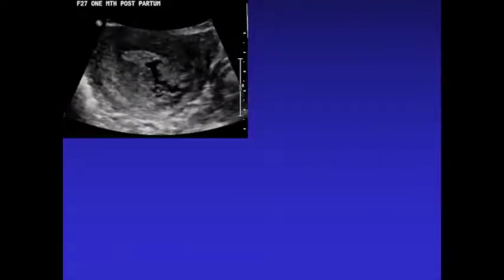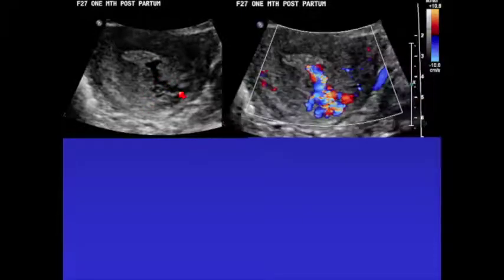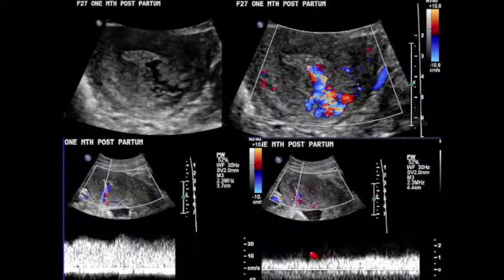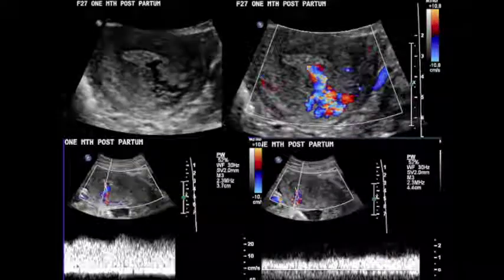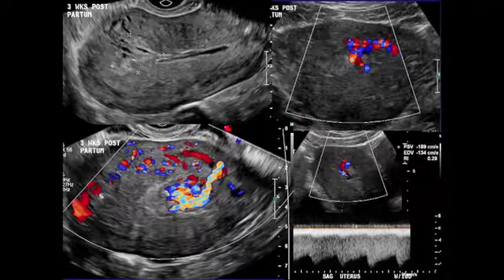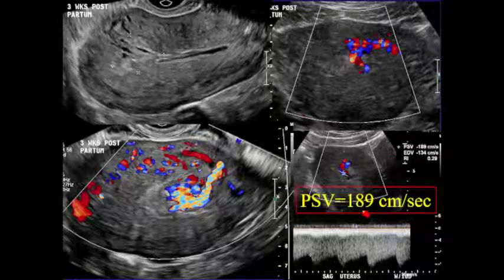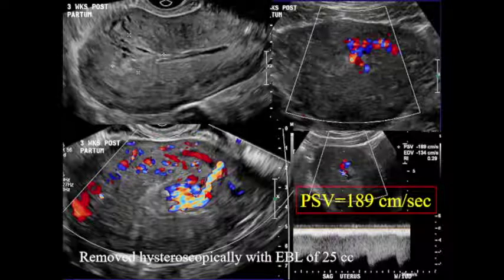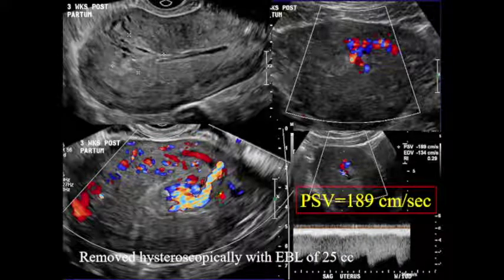Here's a patient with a great big vessel in the myometrium and lots of apparent blood flow on color. But when you actually look at the scale, the peak systolic velocity is actually pretty low — this patient will do well with a D&C. Just looking at color qualitatively doesn't work that well. Here's another patient that looks very similar, but the peak systolic velocity is greater than 80 — in fact 190 — which is really huge. Even though it's only a small vessel, we can qualify that, and this was removed hysteroscopically without a problem.